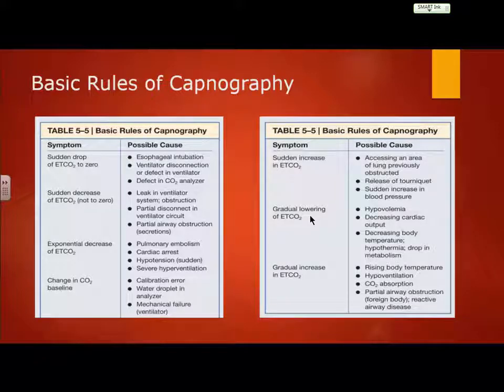Because 35 to 45 is natural. 35 to 45 is homeostatic. 35 to 45 is what the body does on its own. We're artificially pumping the chest, artificially pumping the lungs. Best we're going to get is high teens, low to mid 20s. And that's okay. But then I start seeing that CO2 start rising. I'm going to need to check my other parameters, because chances are this patient's started taking over his own pathways again, and now we've got return, okay?